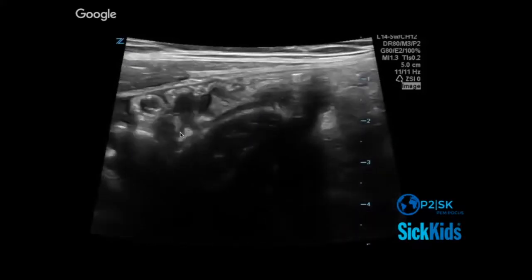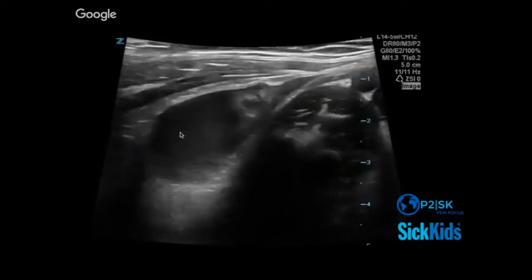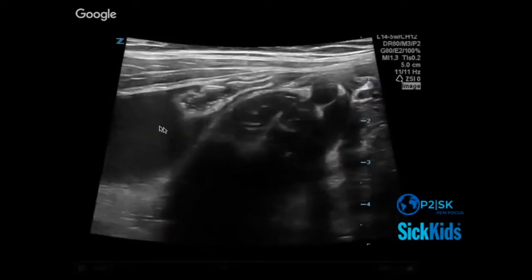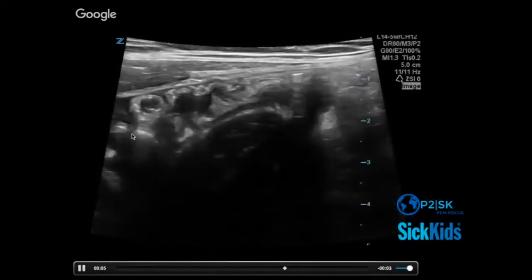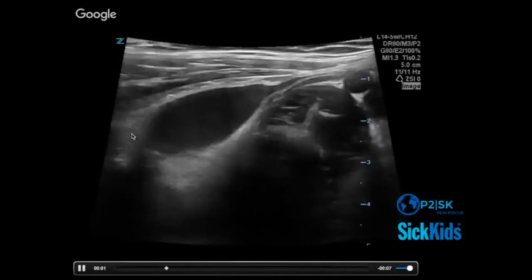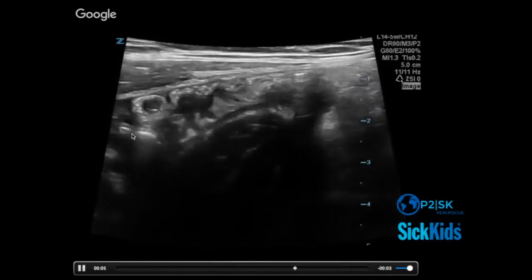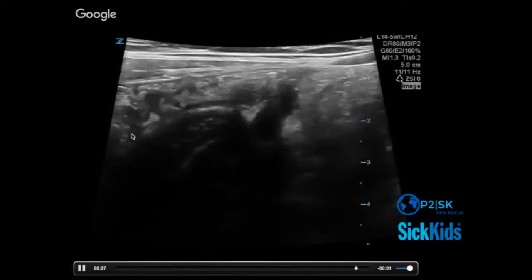So that's kind of the sick bowel wall inflammation in the area appearance that often appendicitis will also produce. And then having larger amounts of free fluid is more predictive of heading towards perforation. Having that fluid become more turbid is more predictive of perforation. You also see this as well.